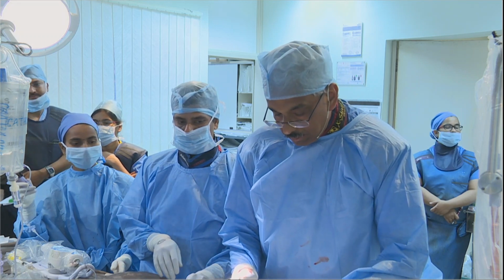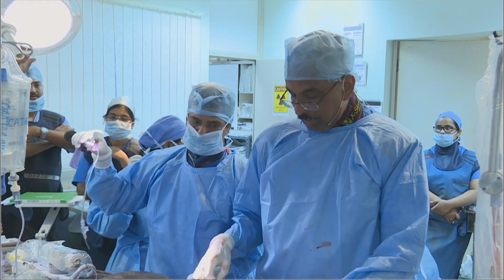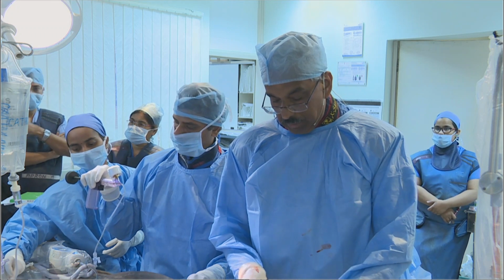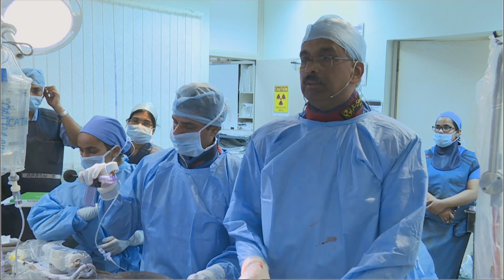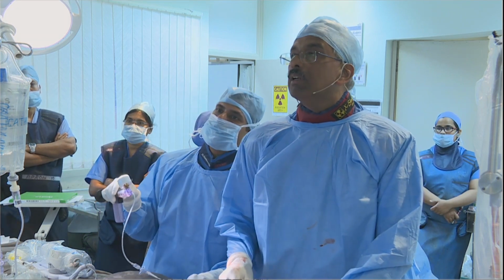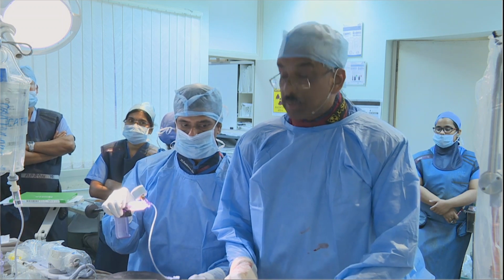Is it a regular wire or is it a Grand Slam? Is it a support wire like a Grand Slam or All Star? I have a right workhorse wire now, like a BMW and Sion, but if I find difficulty, I may shift to an extra support wire.